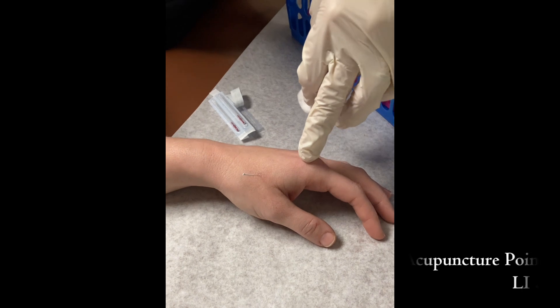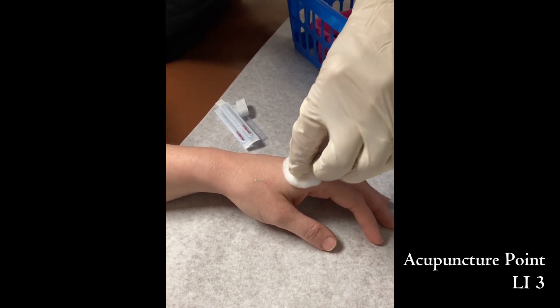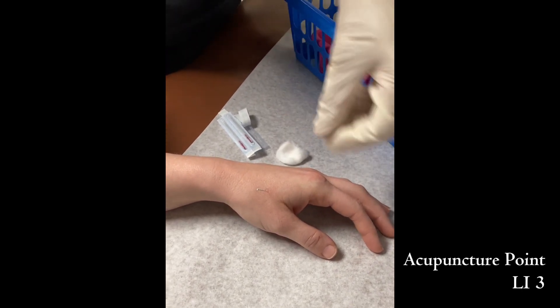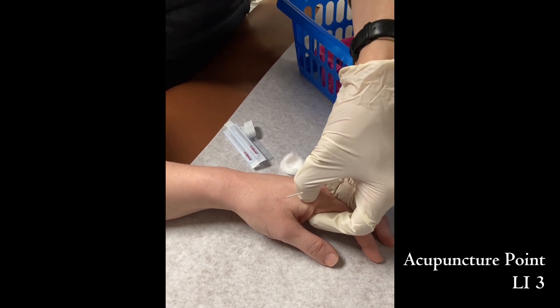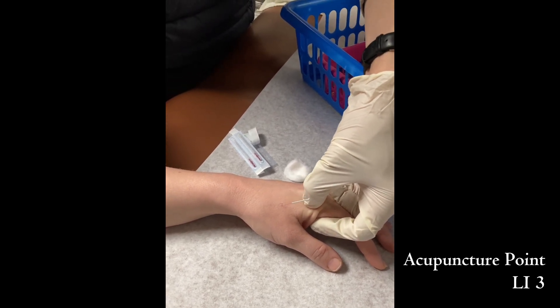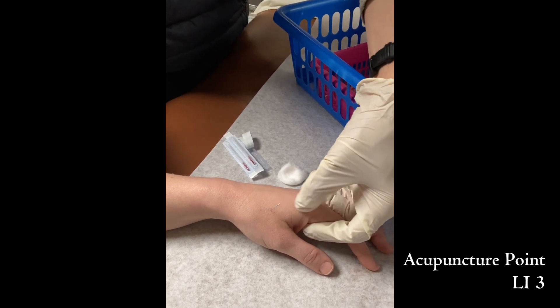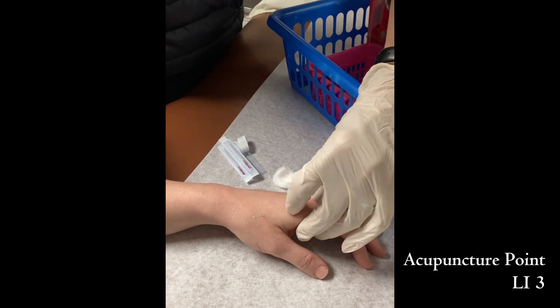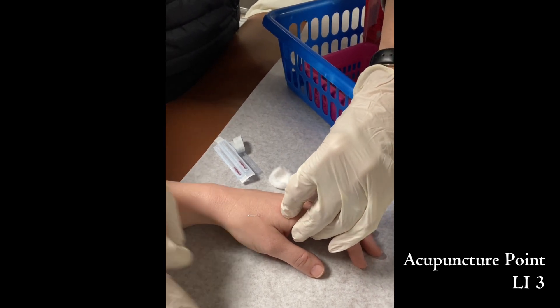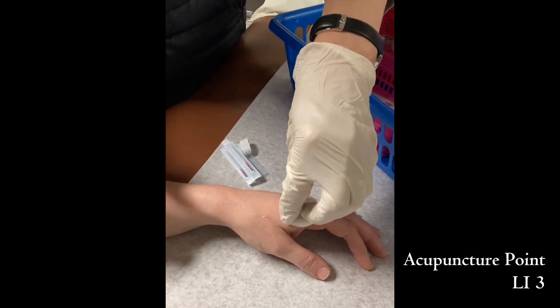The next point you're going to put in is LI3. LI3 is sitting at the turning point where the second metacarpal shaft connects to the second metacarpal head. There's a small indent because of the structure of the bone shape, so we're going to prepare the skin.